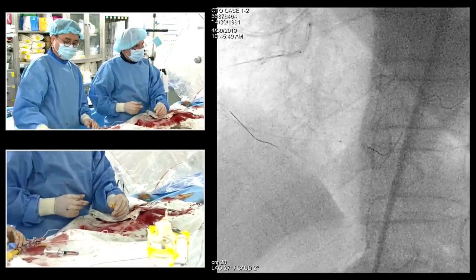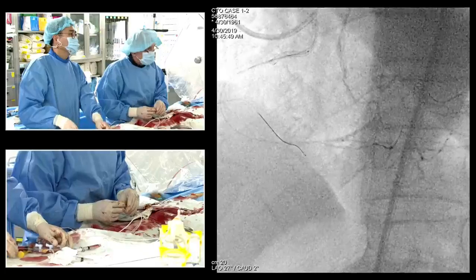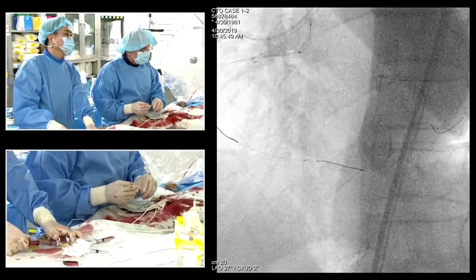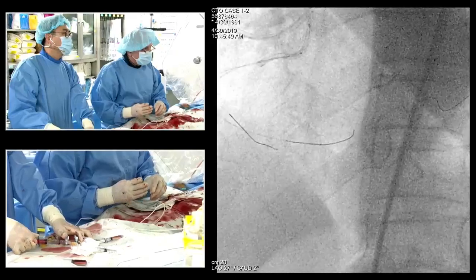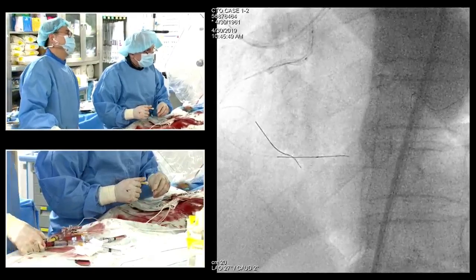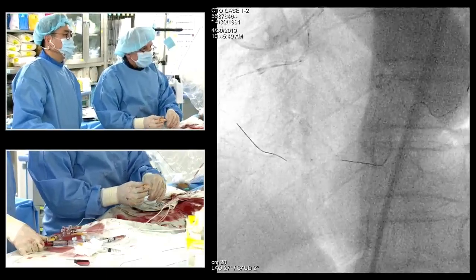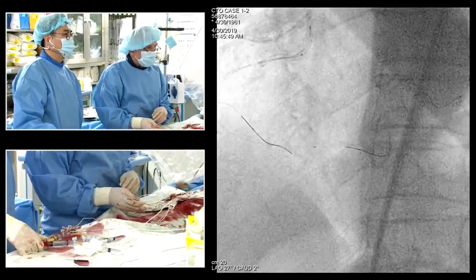Do a left side injection. Left side injection? Yeah. I don't know why. Actually, it should be easy to get to the upper branch. Sometimes easy things are not easy. I don't want to destroy anything. I'm happy with this to do then IVUS, because the stent certainly has to start somewhere earlier.